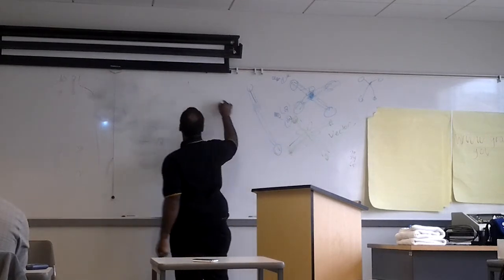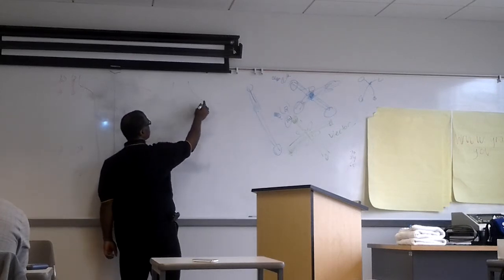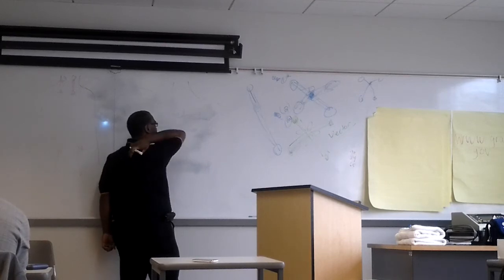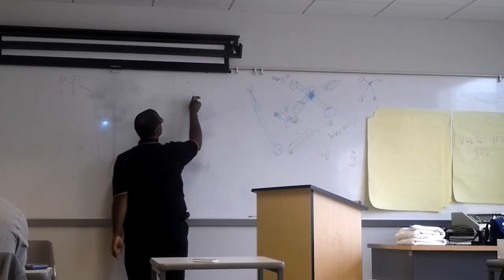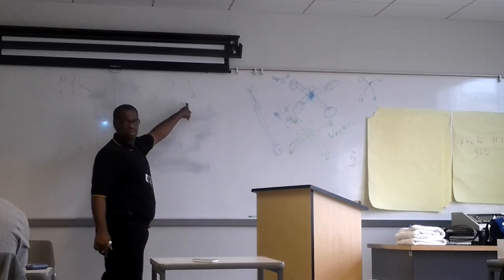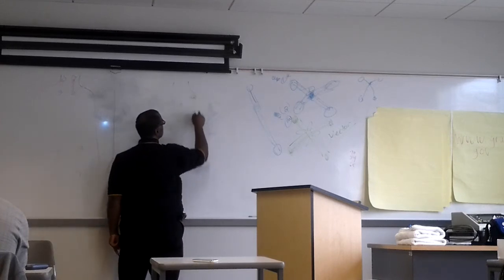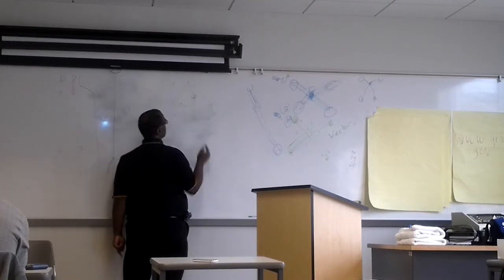So let's say that you had a patient like this here, the shoulder, and up here in the upper traps, they said they had a knot, and sometimes they feel it, and sometimes they didn't feel it, and you couldn't reproduce it every time. Okay. Well, you put an electrode there, an electrode here, an electrode here, an electrode here, and you know it's in here somewhere, but you can't get it every time. Okay. So what you'll do is there's channel 1, and then there's channel 2. Okay. All right.